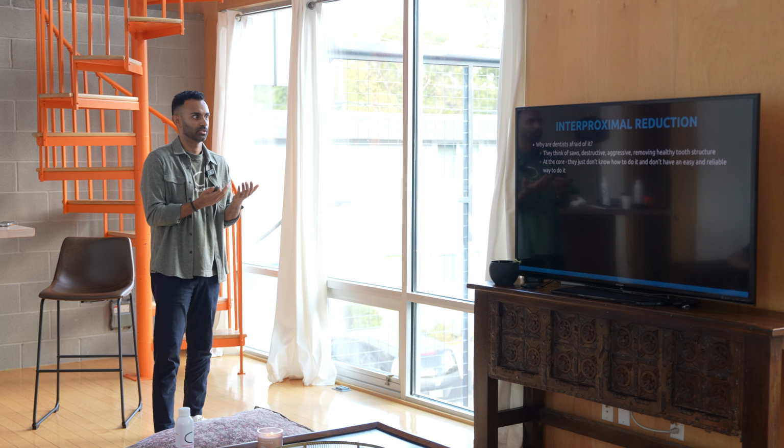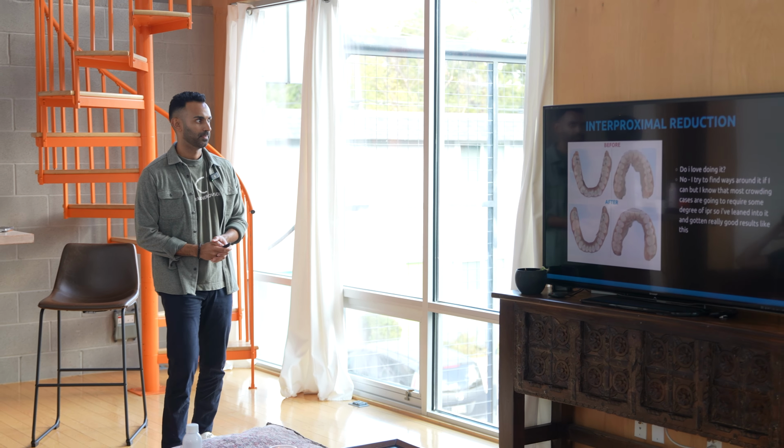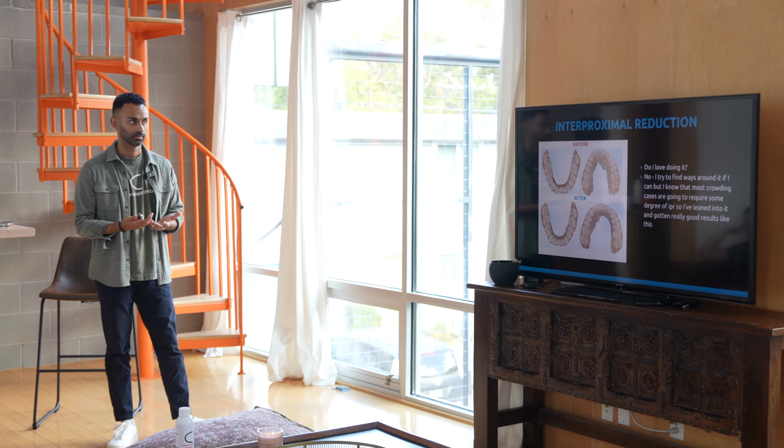But at the core, I know for me, it's I didn't understand it. So when someone's like, hey, create space between these two teeth that don't have any cavities or cracks in them, I'm like, why would I do that? That sounds terrible. That doesn't sound good at all. But what I really needed was I just needed to understand why, and I needed a couple strategies to be able to do it predictably.